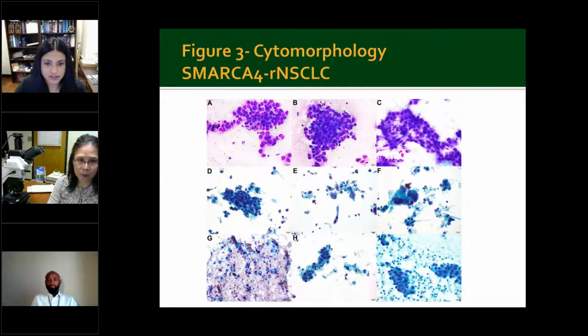Do you agree, Dr. Shi? Anything else you wanted to point out from this image? Yeah, you described it all. Yeah, it's good.